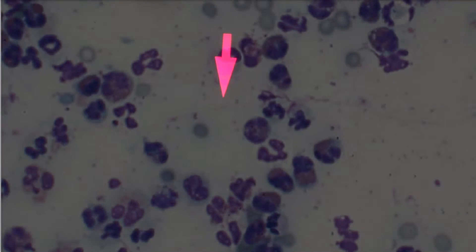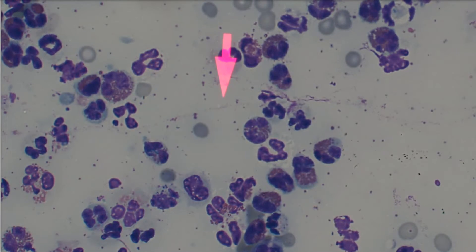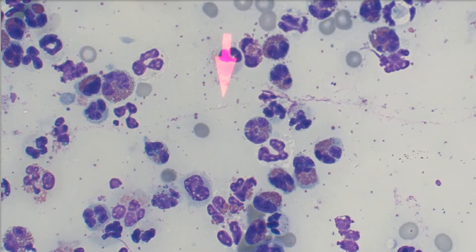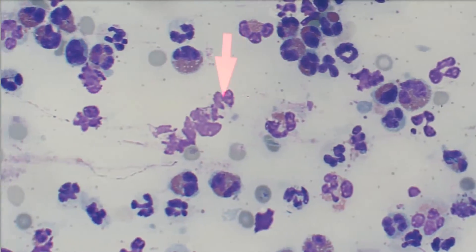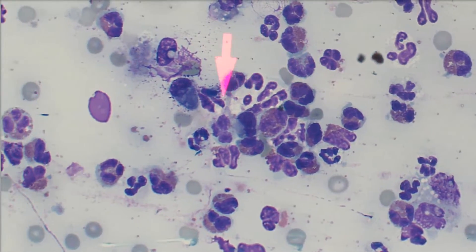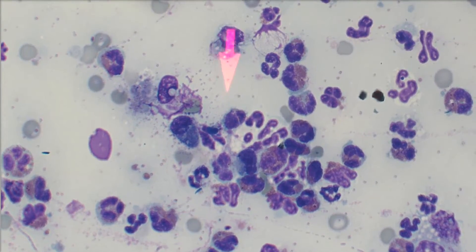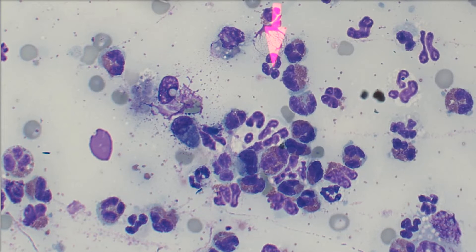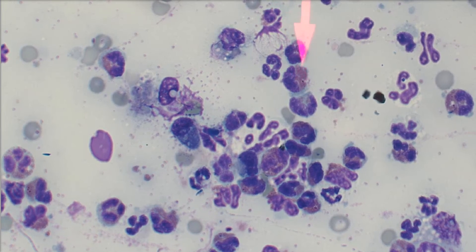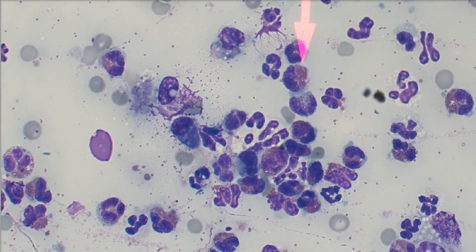Alright, here we are at high power. We can see them in all their glory now. Really inflamed — tons of inflammatory cells here. As I scroll around you can definitely see this same pattern in pretty much every field. The inflammatory cells are a combination of neutrophils — this one is a neutrophil that's kind of busted apart — and then our beautiful eosinophils that have their pretty pink cytoplasmic granules that we all love.